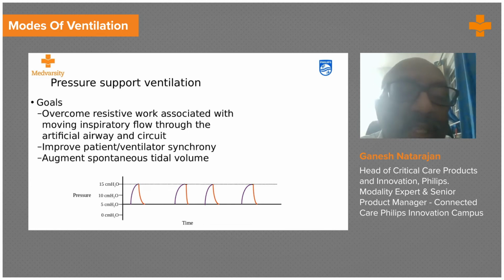It augments the spontaneous tidal volume. It reduces the work of breathing. It also overcomes the initial resistive work that's associated with moving an inspiratory flow through the circuit.